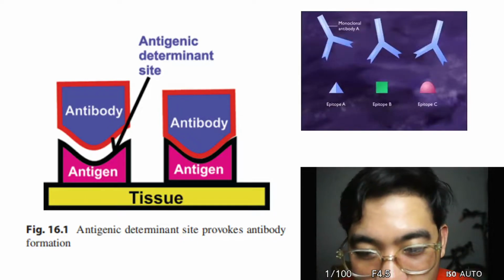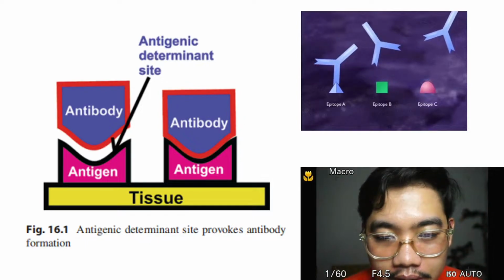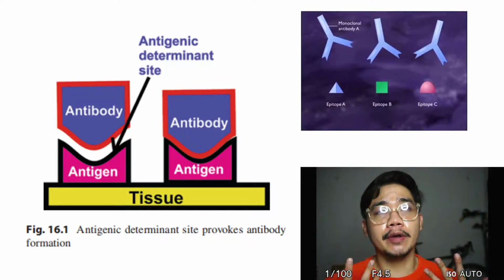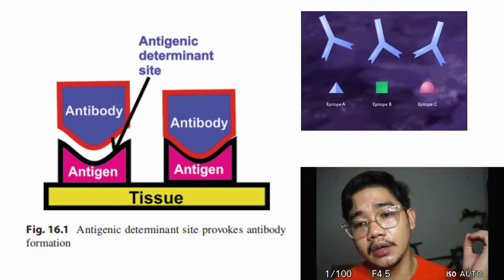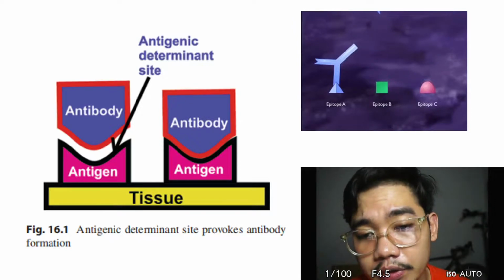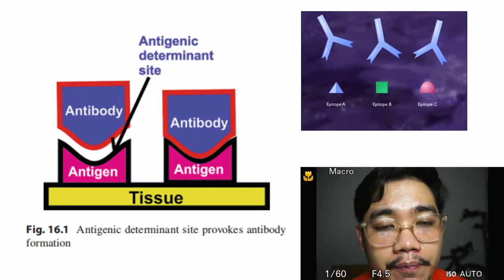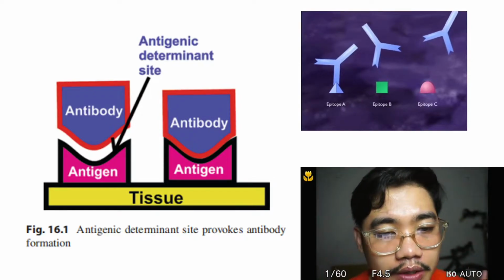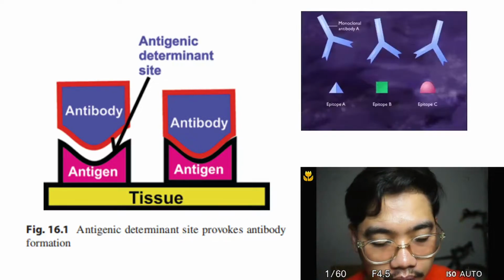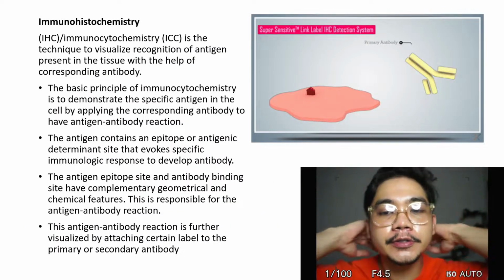As you can see, on the top corner is a GIF. That's your monoclonal, that's your antibody. It attaches back to it. That's the most specific, no? So remember, your antigen has your epitope, meaning it is the key, and then your paratope is your antibody. In the fragment of antigen binding, you will find your hypervariable loops. So that's the antigenic determinant site. So, next slide. For immunohistochemistry, take a look at the GIF there.